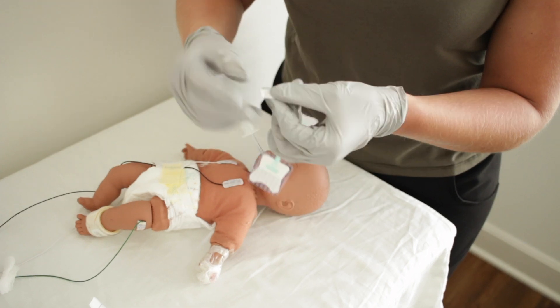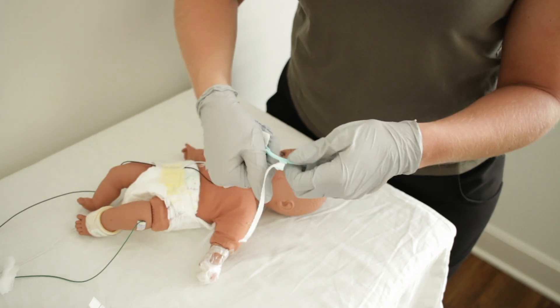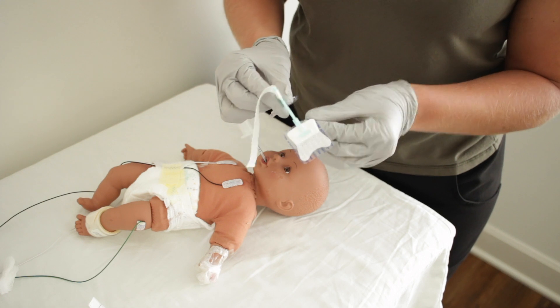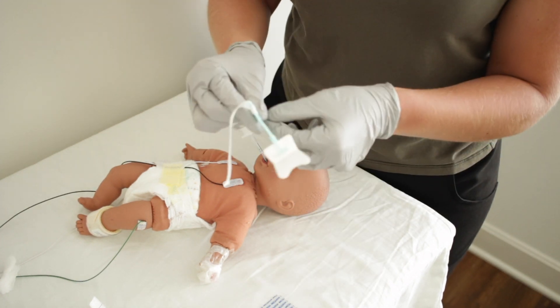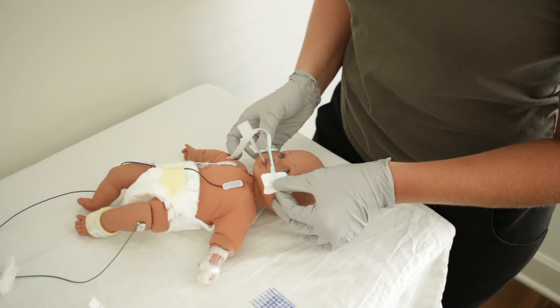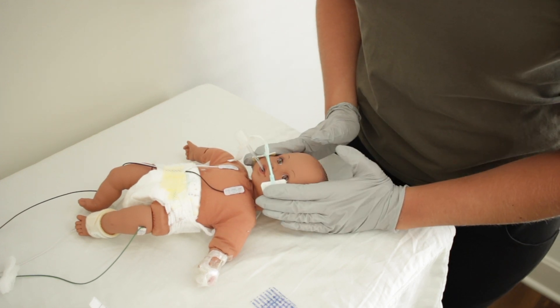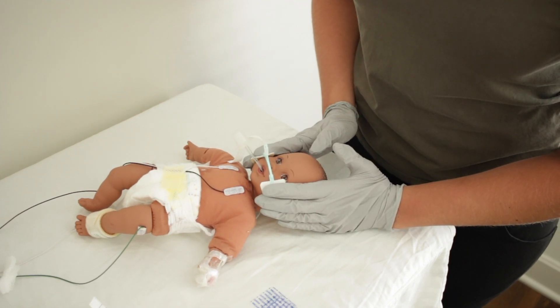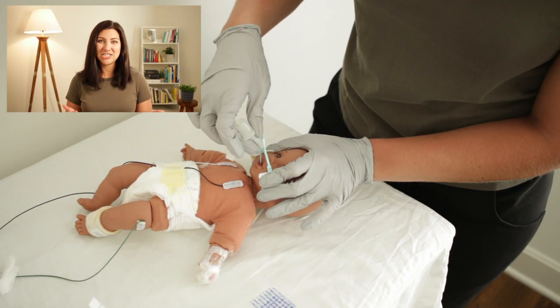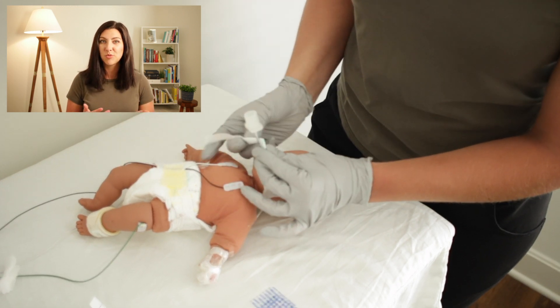This is so much easier than applying the neobar and then wrapping the tape while you're trying to manage the ET tube. So wrap the tape around one time and then apply the neobar to the patient. To apply it, peel the liner on the tabs, center the neobar appropriately on the patient's face, and hold the tabs down for 60 seconds to make sure they've adhered to the patient's skin. After the neobar is secured firmly, take your ET tube and put it on the underside of the platform to prevent any sort of pressure point in the patient's mouth.